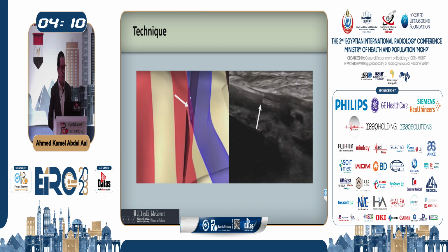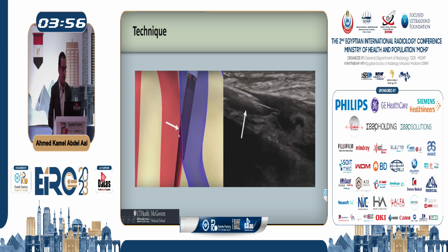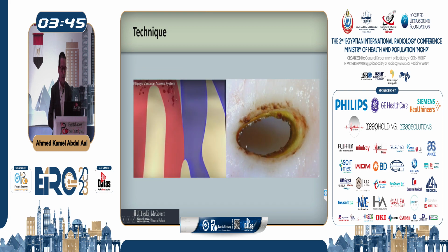And then you place it in such a way that this gap is bridging both the arterial and venous walls together. And then you activate the device by pulling this trigger back, like I told you, so that you can approximate these two metal parts together. And then you activate the device by initiating the thermal energy. As you can see here, just like ablation, you know, any ablation anywhere in the body, you will see these air bubbles. And then you will get this fusion between the artery and the vein.